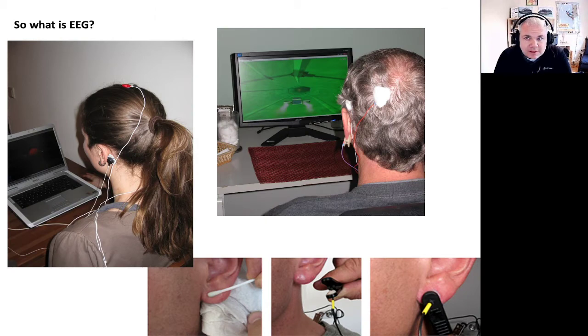This reference electrode that we use is actually quite important, and you'll see some examples of reference electrodes here. In this case, we have a reference electrode that's mounted on the skin surface right behind the ear, and if you touch the back of your ear, you'll find that there's a very big bone there where your jaw mounts into your skull. We use this position because that bone is highly insulating, so there's not a lot of brain activity picked up at this reference electrode. If we then record at a recording electrode up at the top of the head, we'll get brain activity local to that, where we have relatively little brain activity emerging in this reference electrode because of this big insulating bone behind the ear.